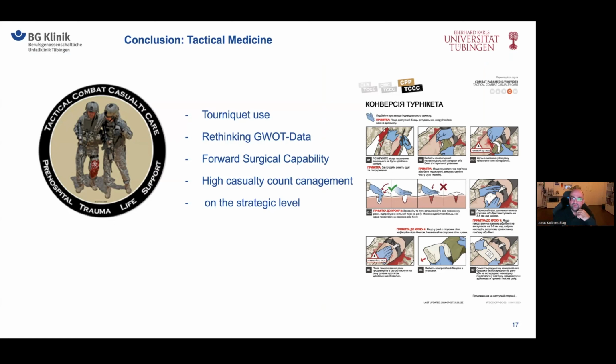I think that a screw fit implant has advantages, and we can use this implant if we have only a head of shoulder, for example. Okay, Jonas. Yeah, I totally agree. So I think that the pictures you saw are among the shortest stumps that are possible at this point in time with the technique we have and with the implants we have.